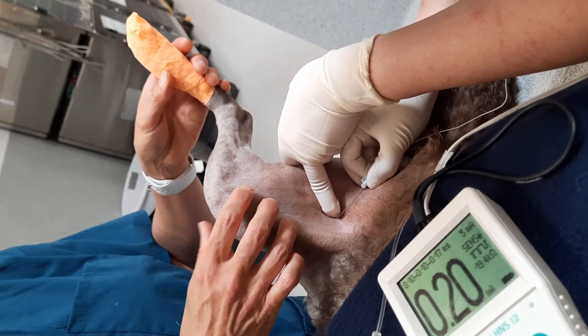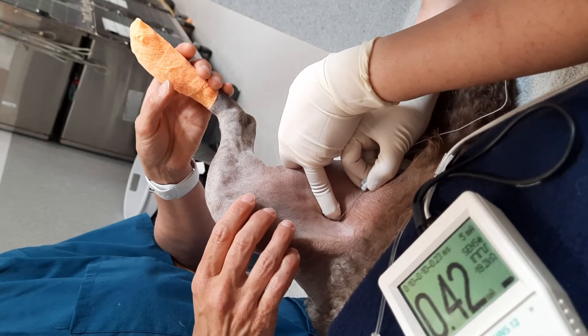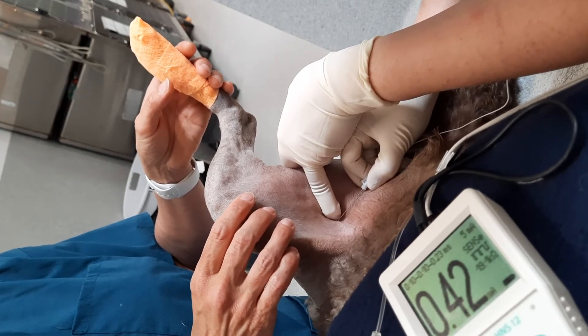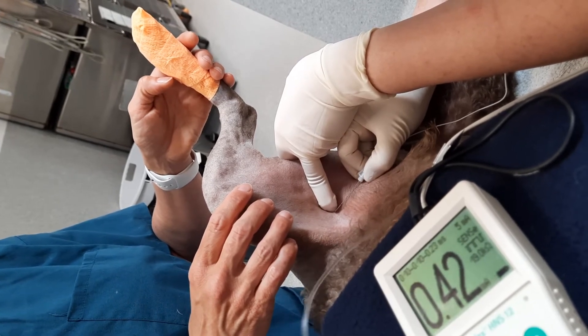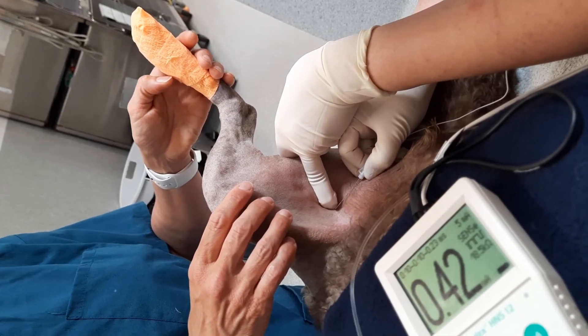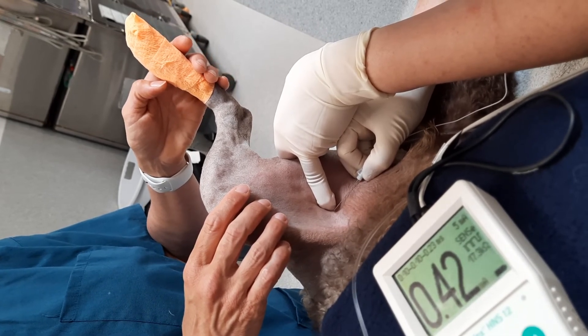We'll increase it to 0.4 again and we can see some kicking, so that's good. We'll draw back and make sure that we're not in any blood vessels — no blood. So we can inject the local anesthesia.